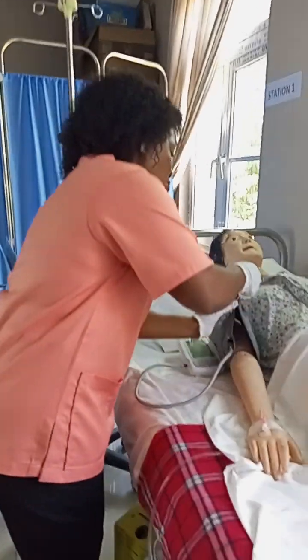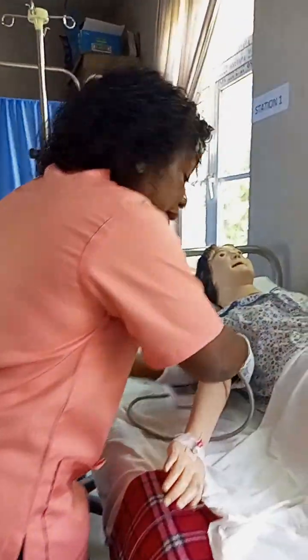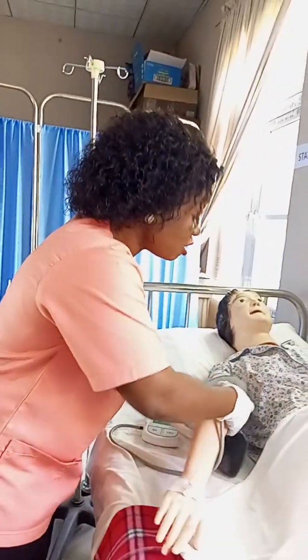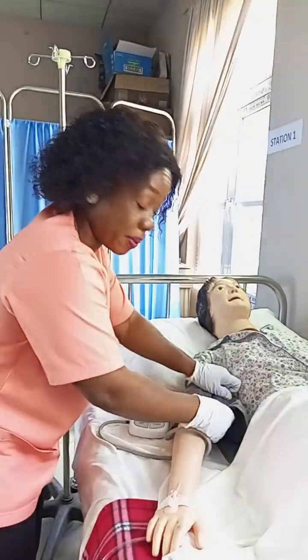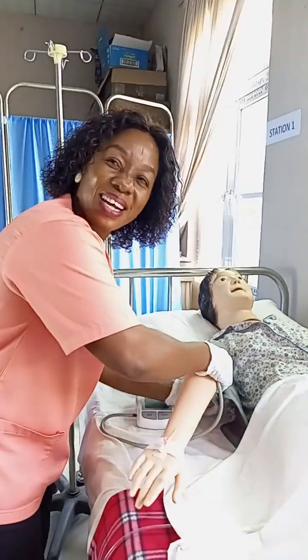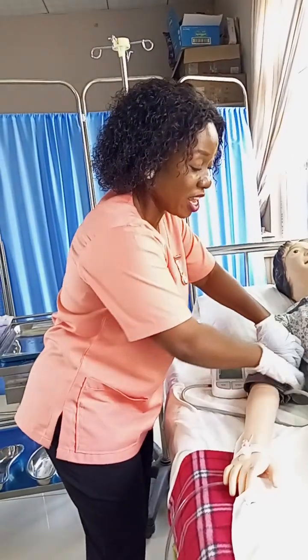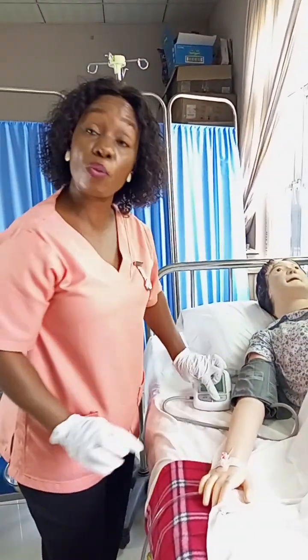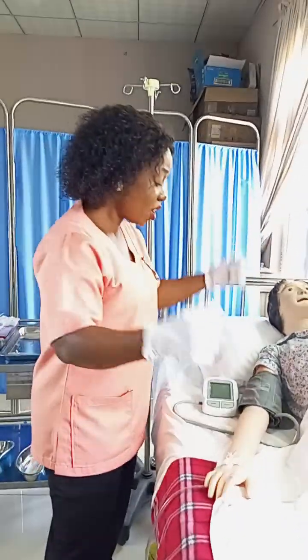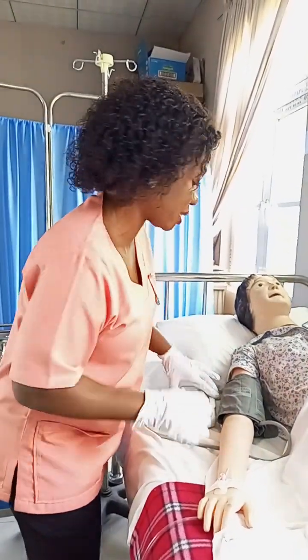Make sure that you check your patient's vital signs properly, because there are marks assigned. There are marks indeed assigned to each and every step. And I know as a student you wouldn't want to miss any mark. Even if it is a quarter, it is important for you to get that mark. So now you place the BP apparatus. Make sure you press the start button. Of course, you press the start button during exams. Do not forget. And then the next thing is for you to place what?